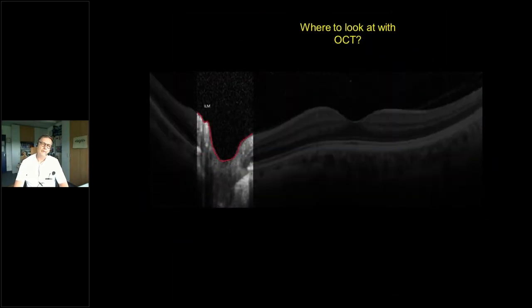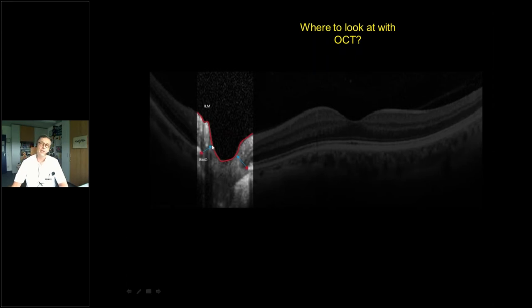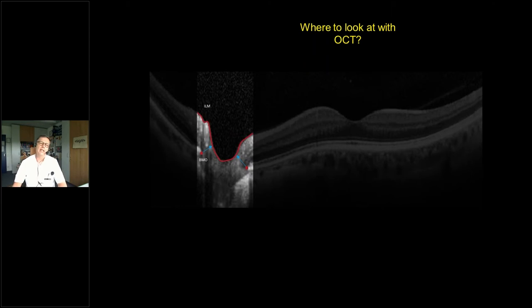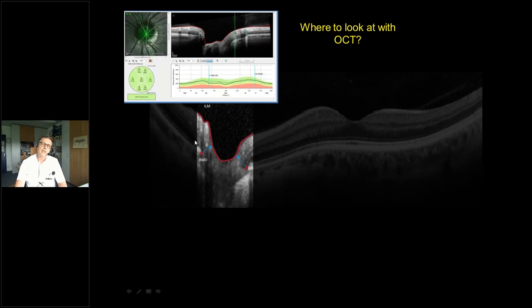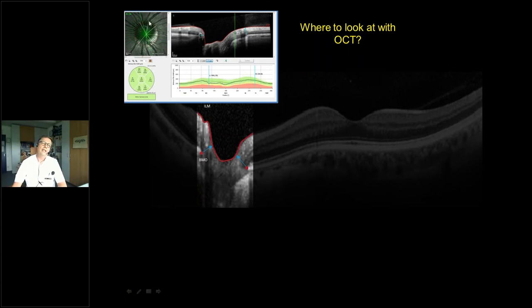To measure the neural rim, the machine finds the ending of the Bruch's membrane opening (BMO), then the shortest distance to the internal limiting membrane gives the rim thickness. Performing this at 48 measuring points gives a good idea of rim thickness. These measurements are compared to a normative database — you see the 95th and 99th percentile thresholds in yellow and red — and you can check each measuring point by sector of Garway-Heath whether your patient is still in the normative range.